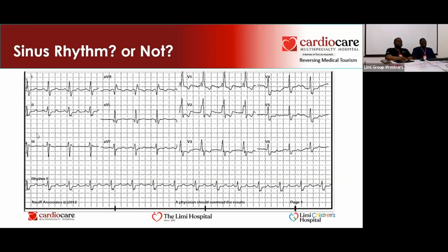Does anybody have any question? Is it clear? Do you have a question? So this is a sinus reading, right? So this one is sinus. The other one was an atrial fibrillation. So it meets all this. So now we go to the next thing.